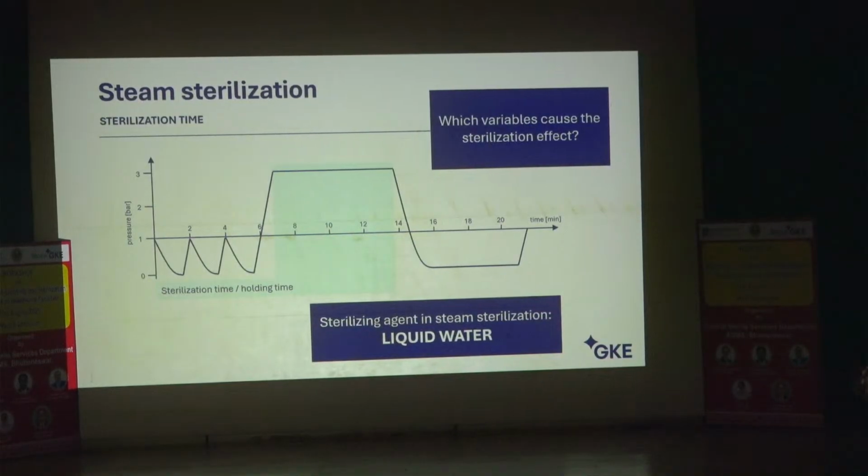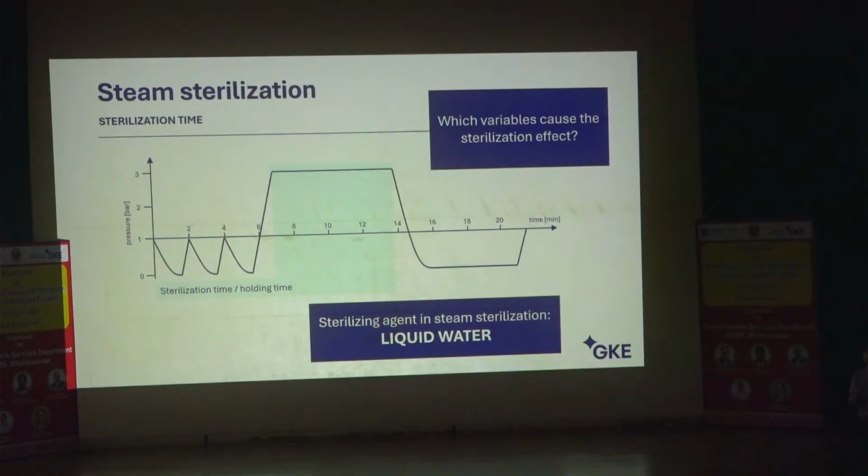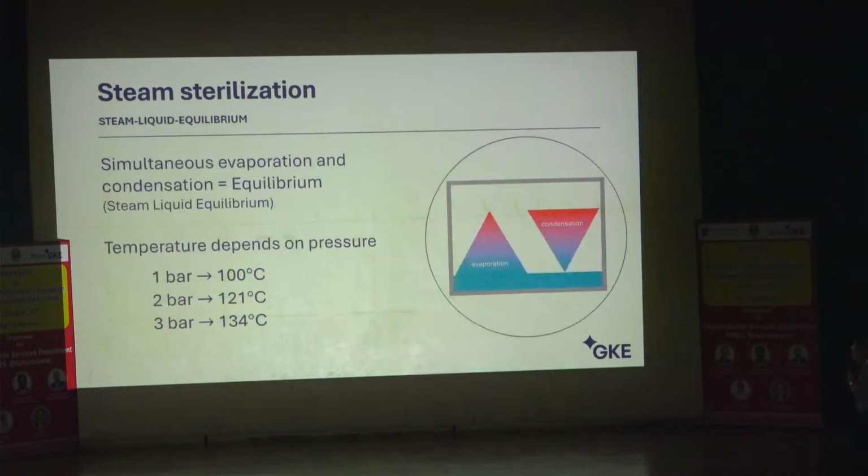And this shows you that temperature and time, oh, do I have 3 minutes or 4 minutes? It's so boring. It's completely boring. The times that we have at 134 degrees centigrade, those 5-minute programs, are much longer than necessary. We are full of security on this page. But the question is, does every surface become wet? Because when you have a surface which is not wet, even a 30-minute program would not sterilize. And this is what we have to monitor.